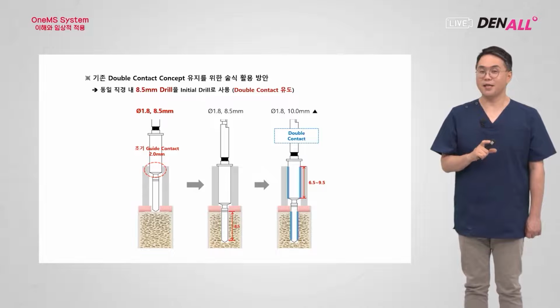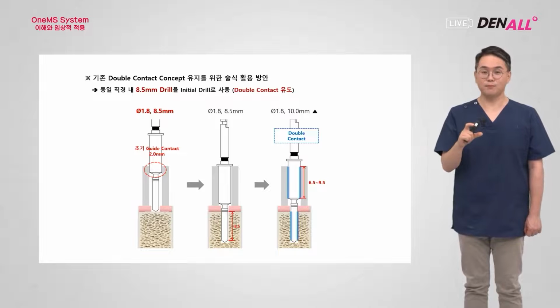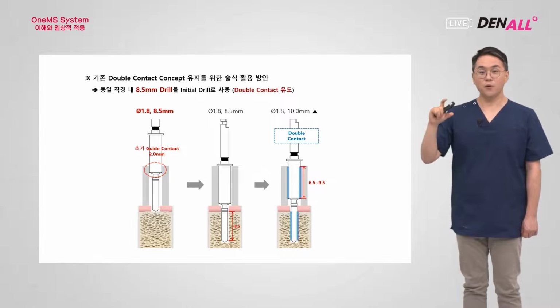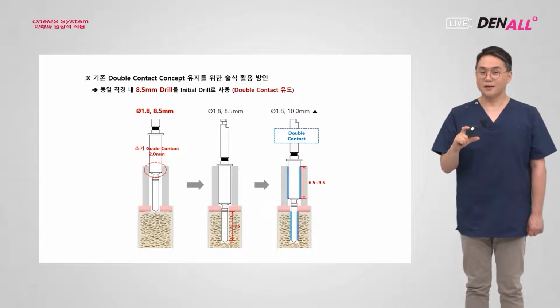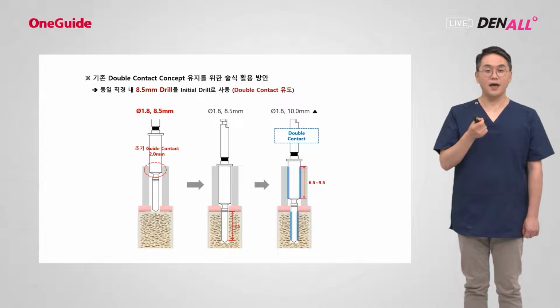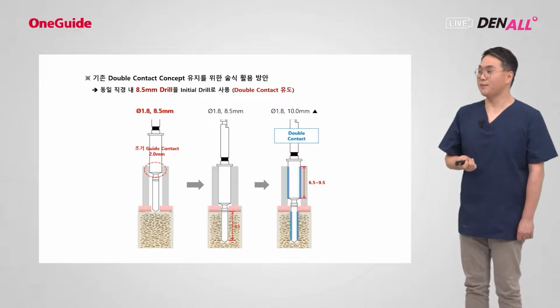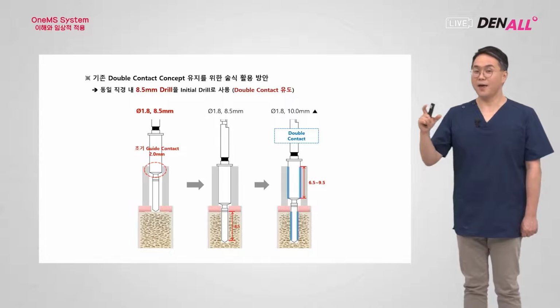11.5 or 13 millimeter implants. In placing even those implants with the OneMS drill, you have to start with the short drill, because if you start with the long drills, and the guide hole's length and the drill length do not match, if the drill is longer, then the guide hole or guide barrel's initial contact would not be possible. So the guide hole cannot guide the drill. In other words, in the same diameter, use the 8.5 as the initial drill, then extend the length.